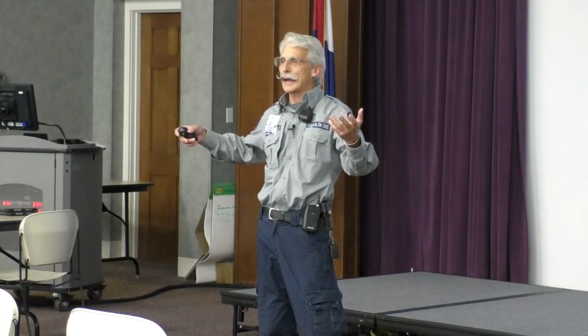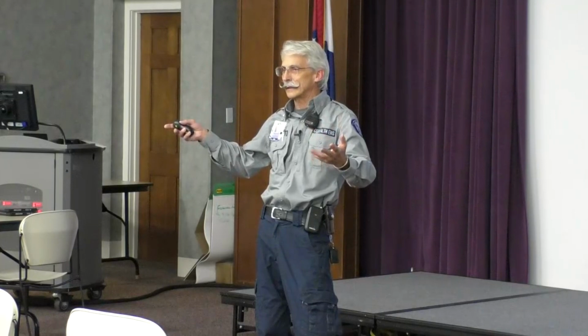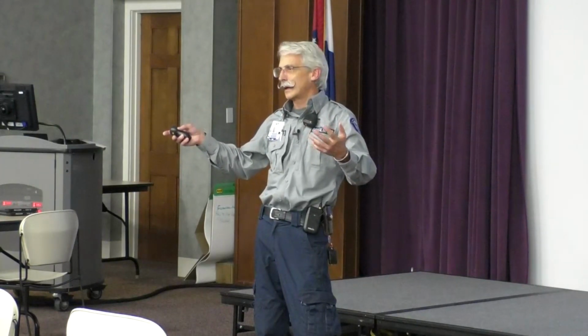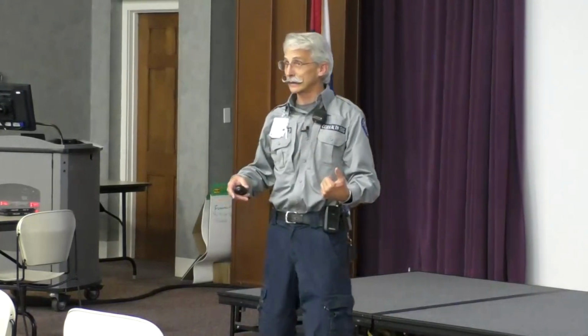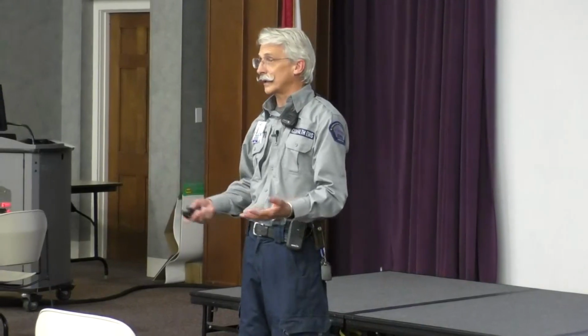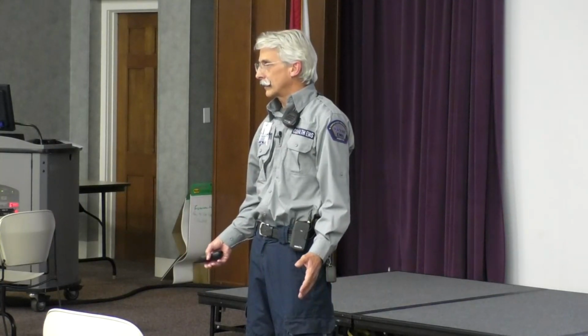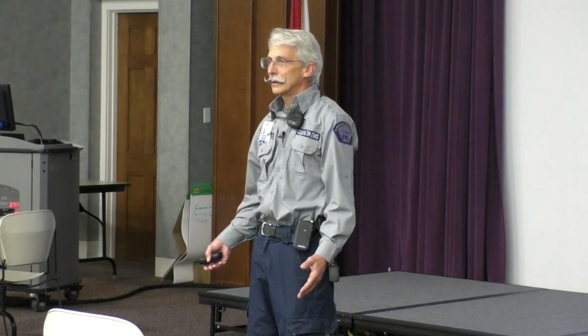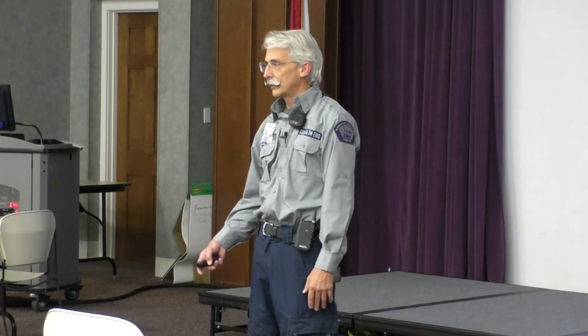Okay, so now we accidentally or we just missed the fact that 2, 3, and AVF, I shouldn't have given them nitro. We pop a nitro in them, or they take it themselves before I get there, right? Because that will happen. They take it themselves before I get there, and they fall down on the floor, right? How do I fix low blood pressure for a person that we gave the nitro to? We do pour the juice to them. What else do we do?